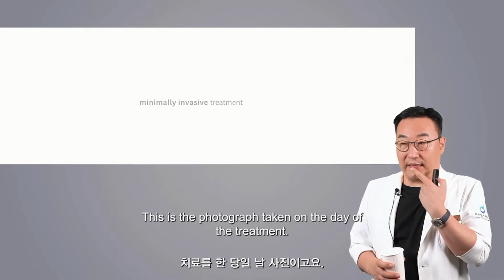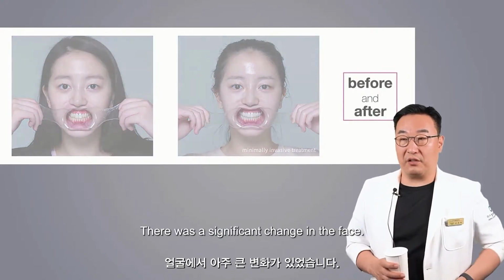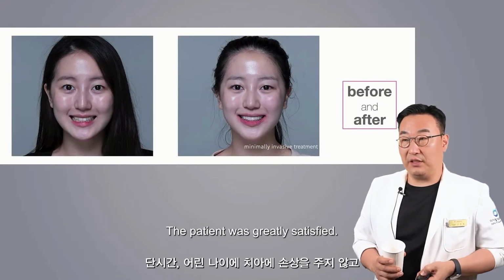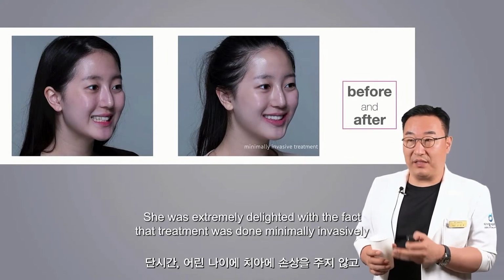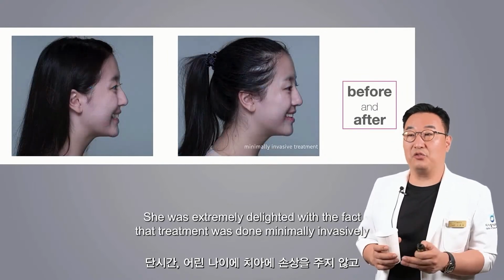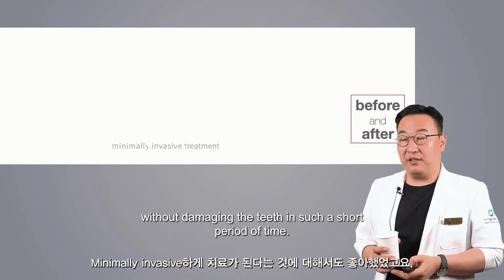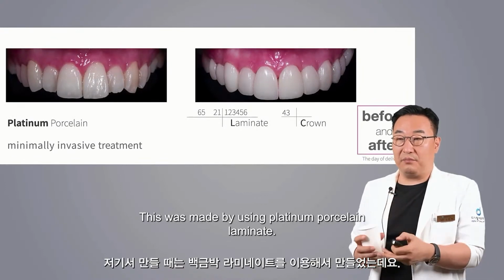This is the photograph taken on the day of the treatment. There was a significant change in the face. The patient was greatly satisfied. She was extremely delighted with the fact that treatment was done minimally invasively without damaging the teeth in such a short period of time. This was made by using platinum porcelain laminate.